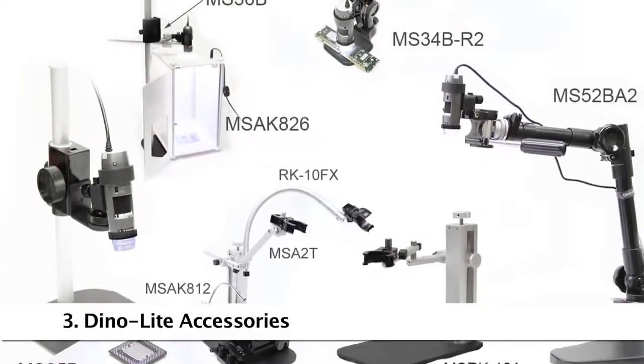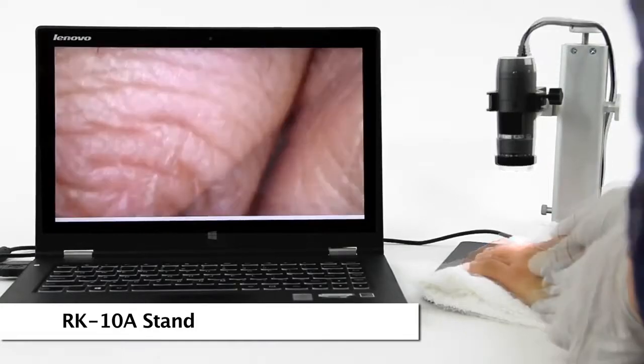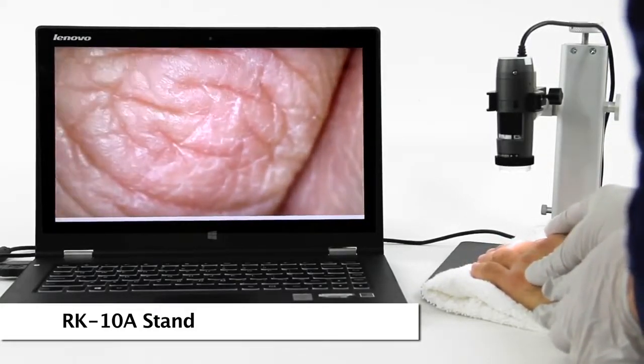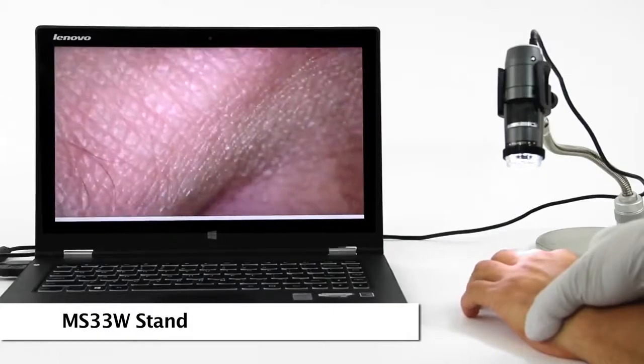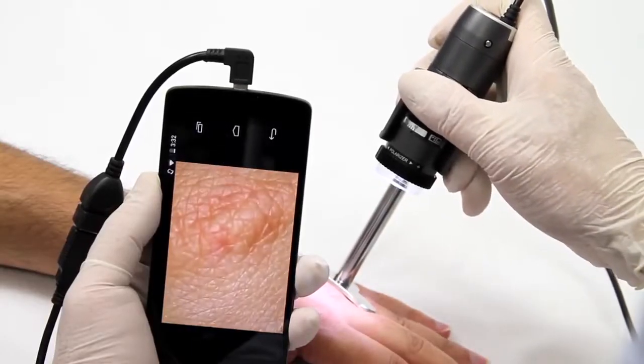Here are some compatible and recommended accessories. The RK10A is a tabletop stand with a quick release button and fine adjustment. The MS33W is an articulating stand, good for simple adjustable angles and movement. The different portable handheld stands are also great for quick skin examination.